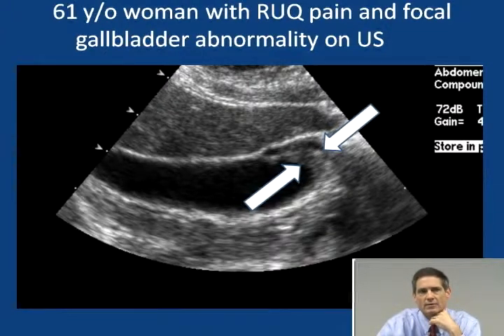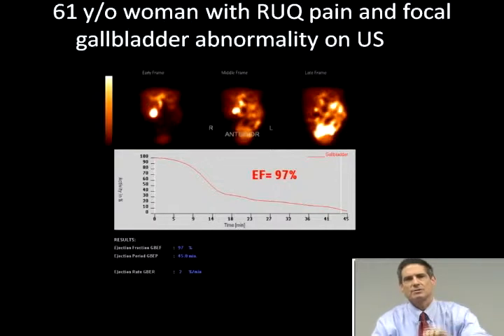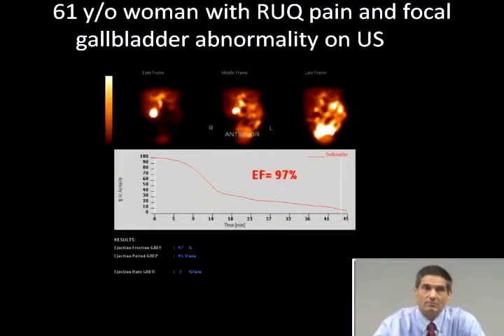usually an asymptomatic abnormality. So in this case, she did undergo a nuclear medicine study, prompt visualization of the gallbladder, as well as the liver biliary tree and small bowel, just like you'd expect with a normal study. Cholecystokinin injection resulted in 97% ejection fraction, very nice, absolutely normal study. So this would confirm probably a normal gallbladder, and subsequent endoscopy showed that the patient had gastritis and Brunner gland hyperplasia. She responded to treatment for those processes found at endoscopy, and the gallbladder abnormality seen on the ultrasound was probably an incidental finding. And the nuclear medicine study helped put at rest any issues about biliary dyskinesia.